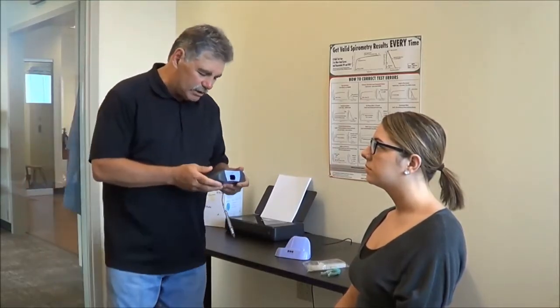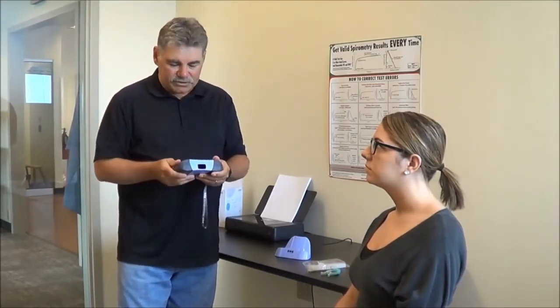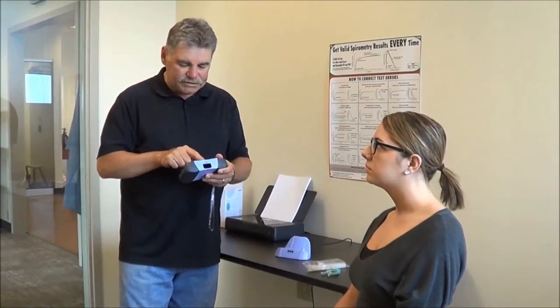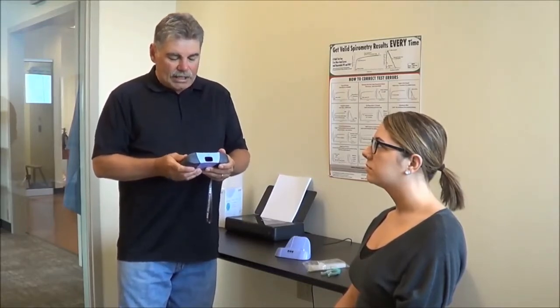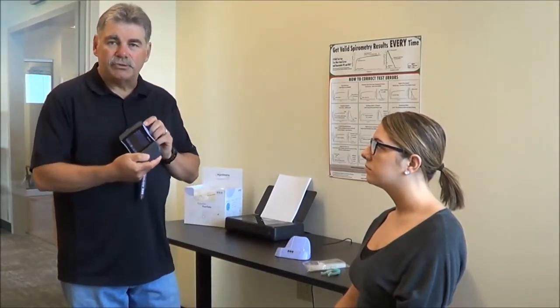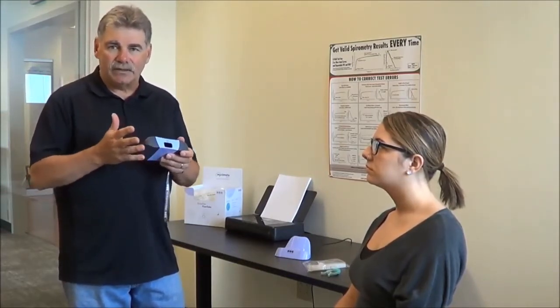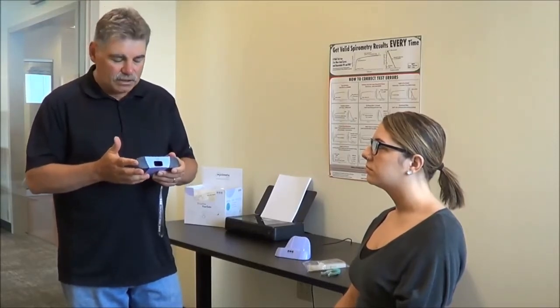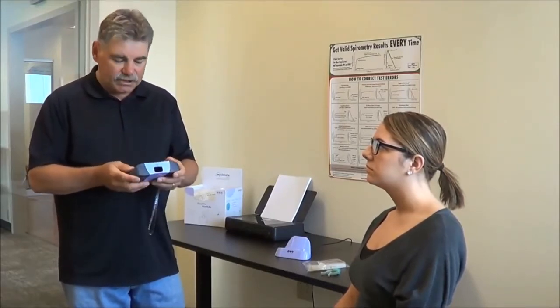To get started, I pick up the device and turn it on. I get a main menu here with a bunch of things I can do, and I'm going to choose FVC to start the test. The first screen I see allows me to either add a patient or choose a patient that has already been added. If you're adding a new patient, it's important that the age, sex, height, and ethnicity be entered correctly.